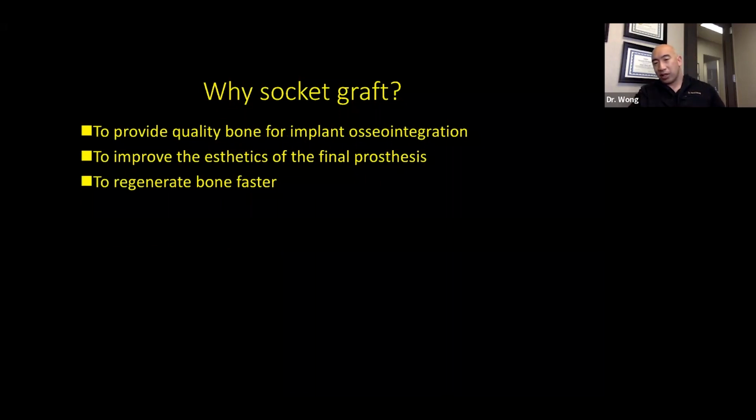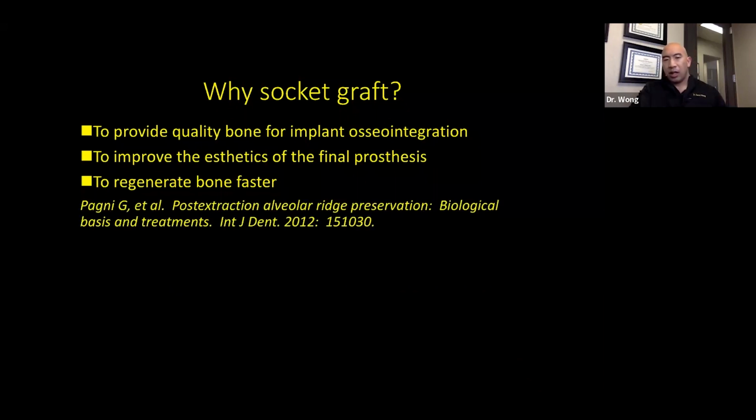Patients also want to get started faster. So if they're not a good candidate for an immediate implant, like I showed you earlier with some of those blown out facial and lingual plates, this gives us the best chance at regenerating the bone as fast as possible so that we can get a move on with the implant and the final restoration.